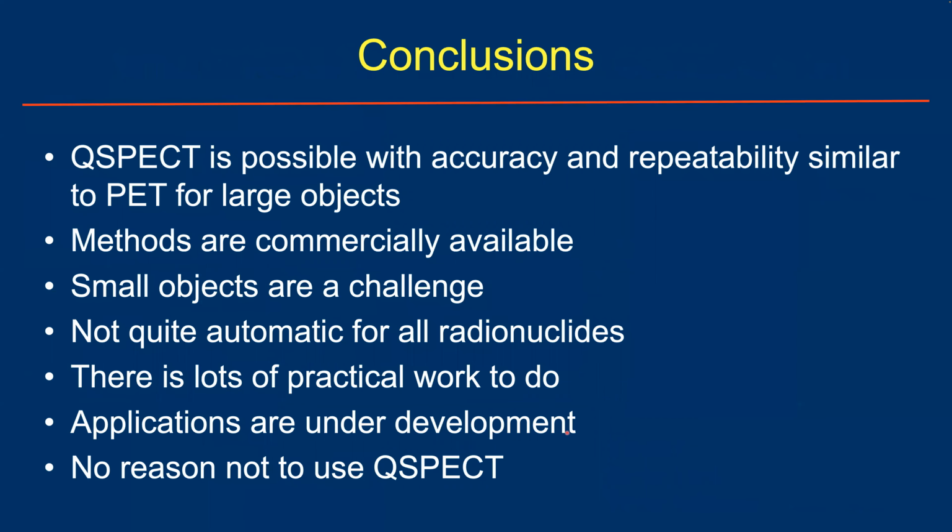So in conclusion, quantitative SPECT is possible, accurate and repeatable, which is similar to PET imaging for large objects. There are methods that are commercially starting to become available. Both Siemens and GE have implemented quantitative reconstruction methods in their commercial products. So they are available in clinic now. And imaging small objects is still challenging because of the partial volume effect. Therefore, careful partial volume compensation is required.